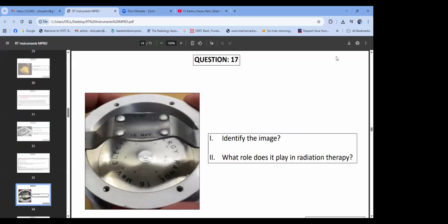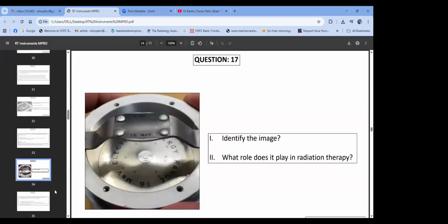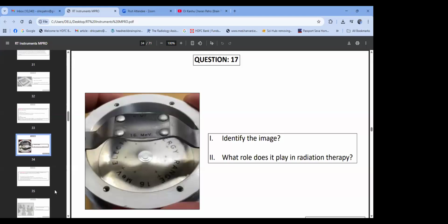The electron beam that is produced will be a pencil beam. So we need to get a homogeneous beam across the treatment field. So we'll keep the scattering foil in the pathway of the electron beam, and that will produce a homogeneous electron beam radiation for the treatment. Okay. So the primary function is this, it will give a more uniform and broader treatment field.